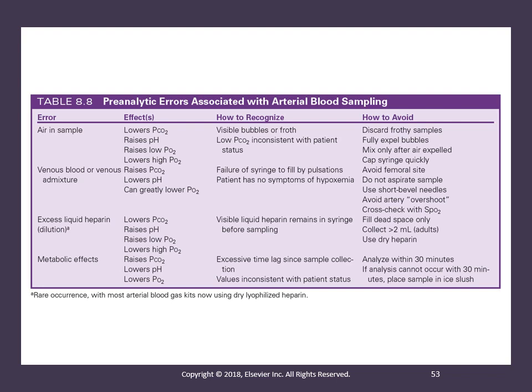The blood gas quality control measures should be followed to help avoid errors during sample analysis. To minimize analytic errors requires regular calibration of the measurement device. Calibration involves exposing the analyzer to calibration media at 2 or more known levels of measurement.